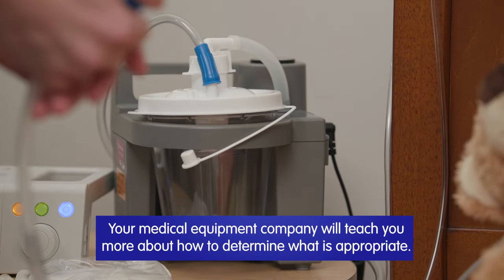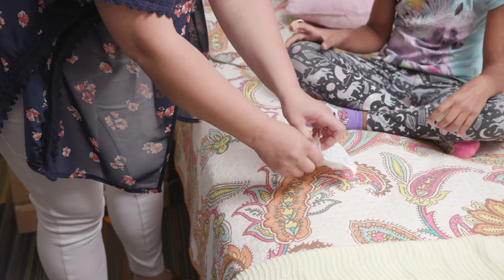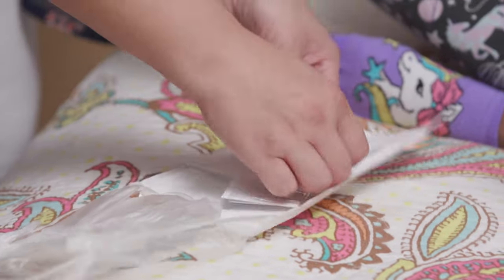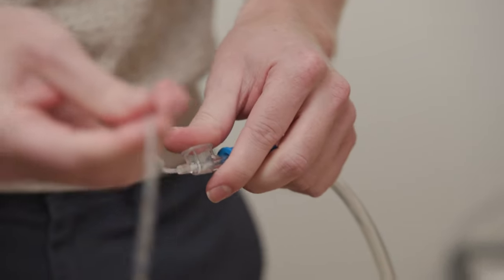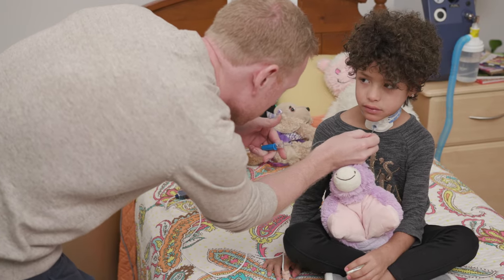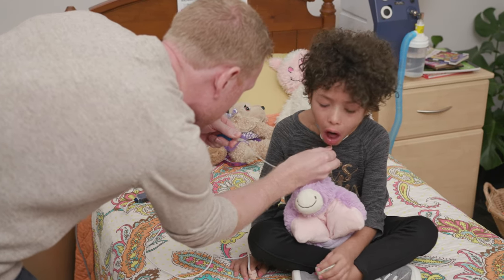Turn the machine on and check for safe suction pressure. Remove the suction catheter from the package. Be careful not to touch the part of the catheter that goes into the tracheostomy. Attach the suction catheter to the suction machine tubing. With one hand, place your thumb and first finger at measured suction depth while holding the suction tubing with the other hand. Insert the catheter to safe suction depth. Place the thumb over the suction opening.